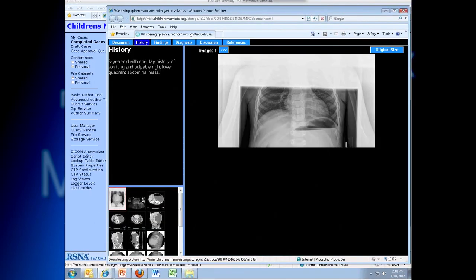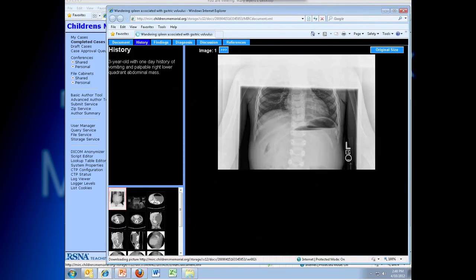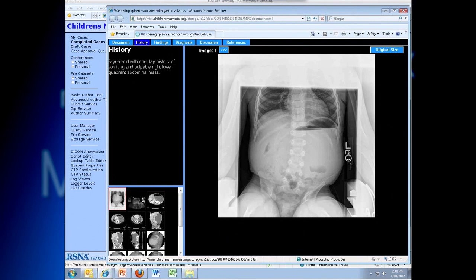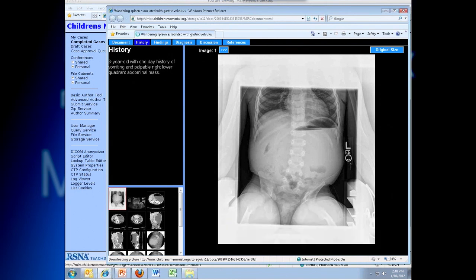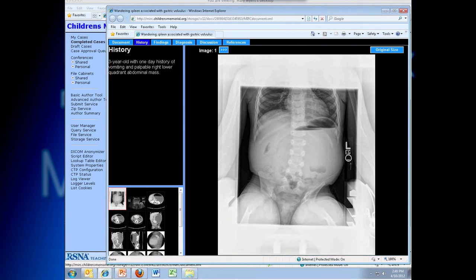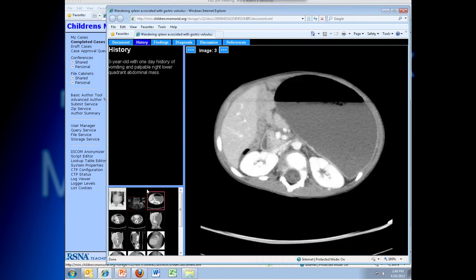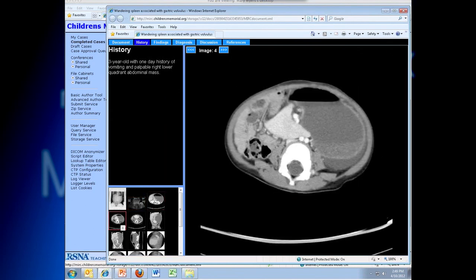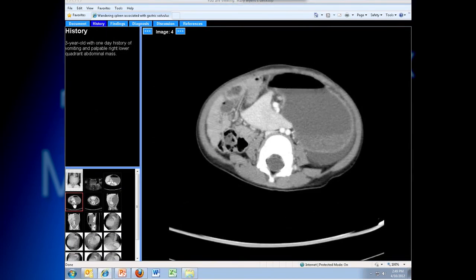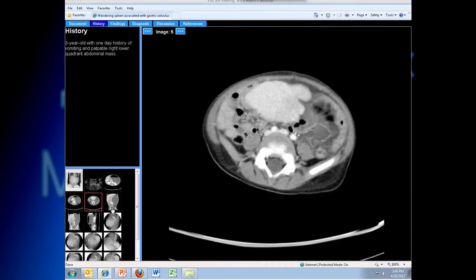This case is a patient with a wandering spleen and an associated gastric volvulus. This was a three-year-old boy, and we have multiple different imaging modalities shown in this case. There's a plain film, we have an ultrasound, and we have a body CT.